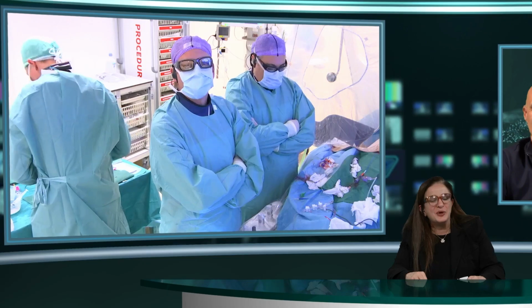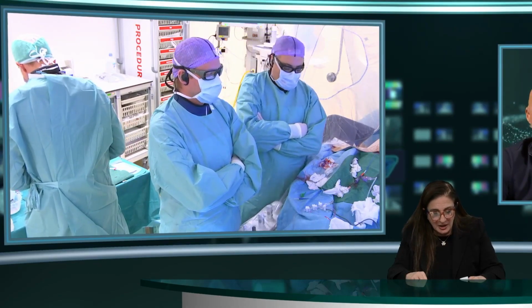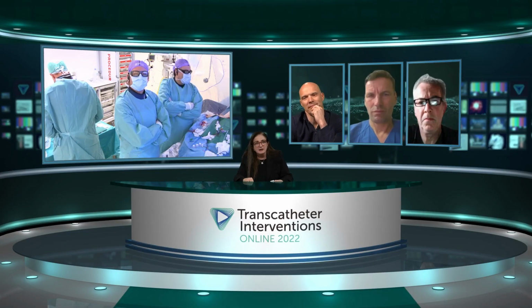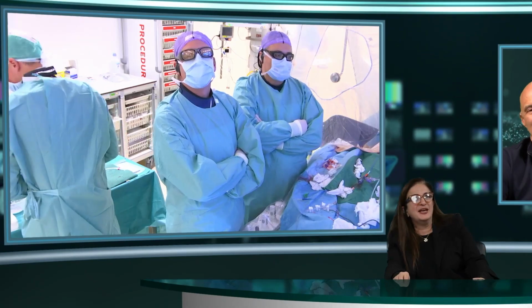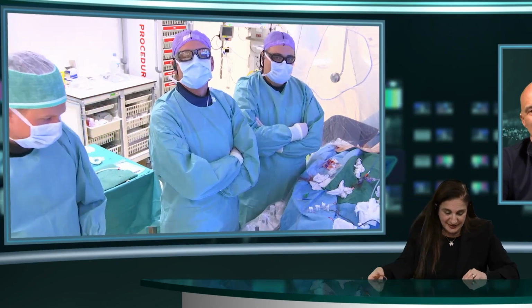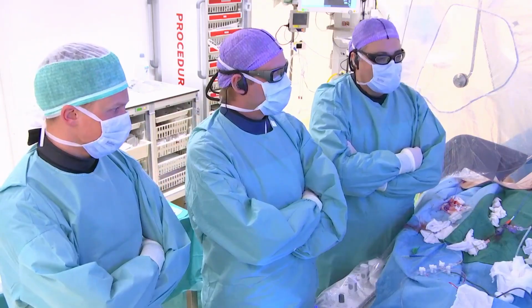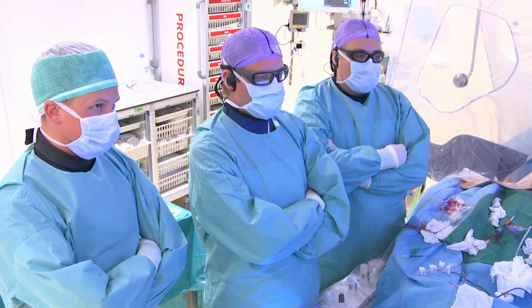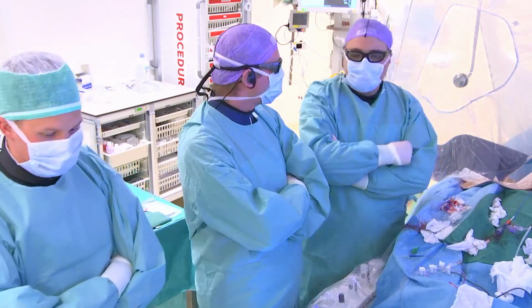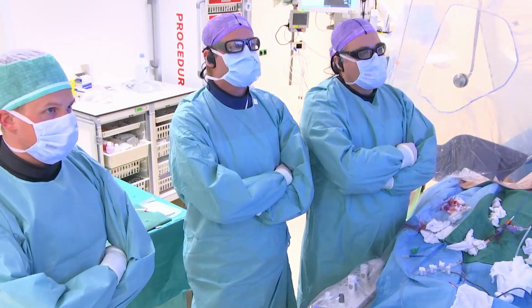So lovely to have you both here, and you have a great panel here as well with Holger Thiel, Nicholas Van Meegen, and David Hildick-Smith. So Roberto, to the case, please go ahead and give us your case. Yes, today we have a very interesting case of a complex CTO PCI of ostial LAD, but I would like first to introduce my colleague and friend Jeroen Wilschut and my nice team. Maybe we can start immediately having a look at the case.